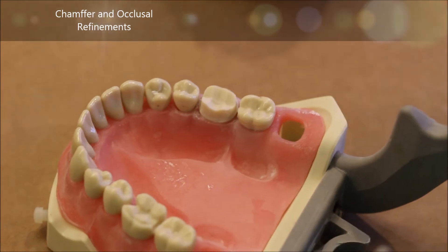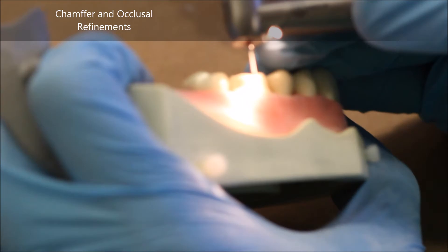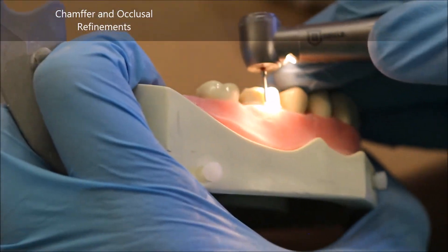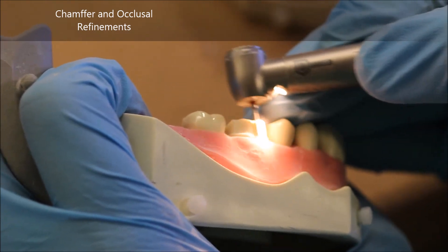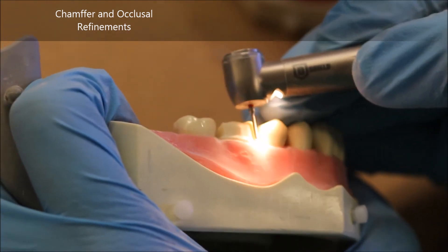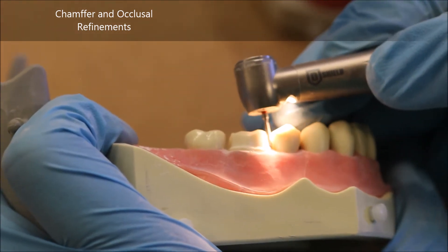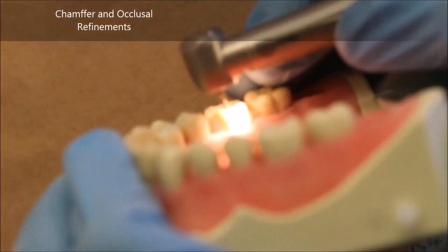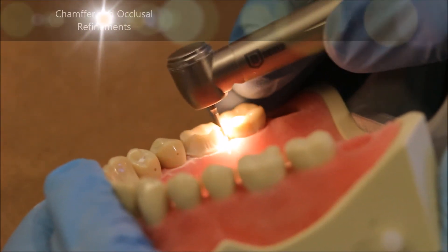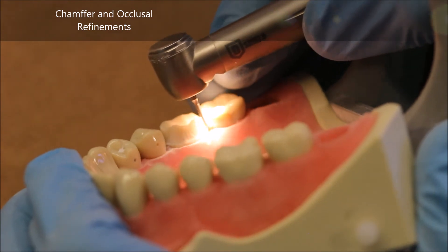The 8877 is also ideal to make your finish line as smooth as possible and smooth out any imperfections in your axial walls. It has the perfect shape to maintain your chamfer margin and make it very clean when it comes to capturing it for an impression or making a temp. The 8877 is also thin enough to go through the interproximal assuming you've done sufficient axial reduction — if it's not going through, you need to do more axial reduction.